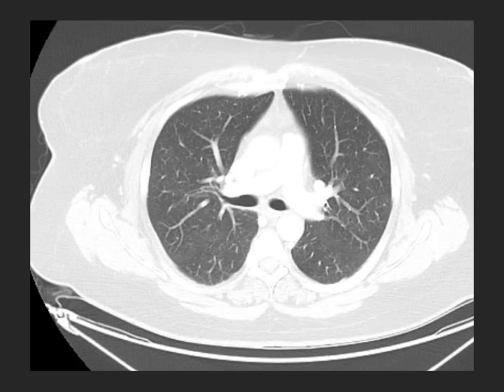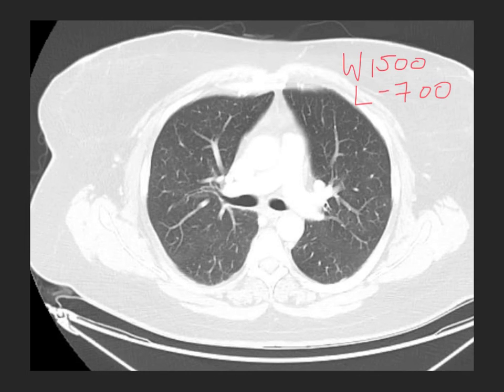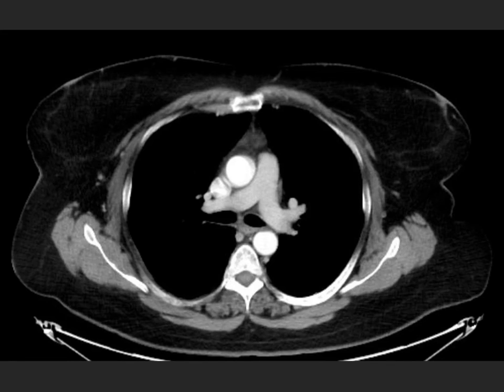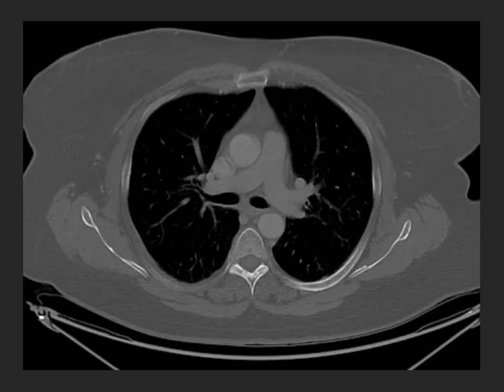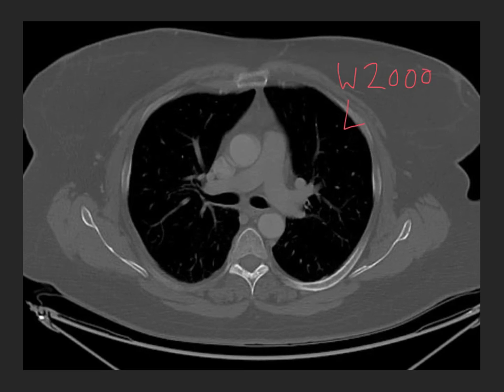Here is a commonly used lung window for chest CTs: window of 1500, level of minus 700. Here is a soft tissue window for the mediastinum or abdomen: window of 400, level of plus 40. And a typical bone window to look at the skeleton: window of 2000, level of plus 300. You can see these values vary fairly dramatically depending on what tissues we want to look at.